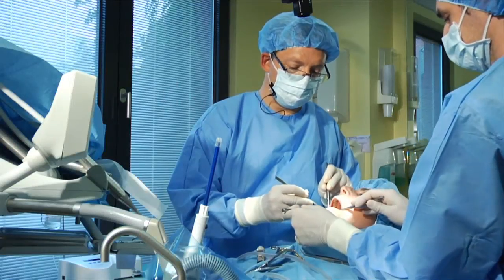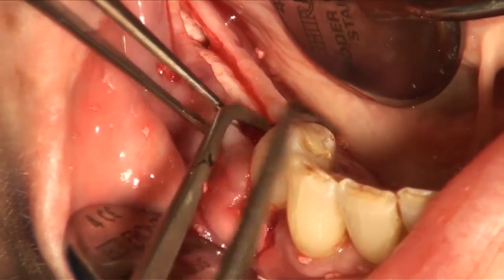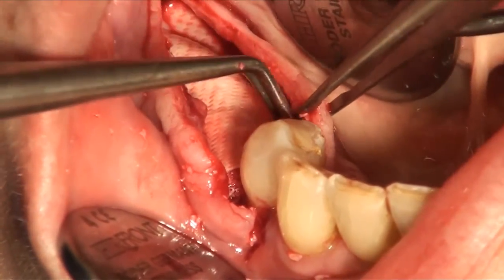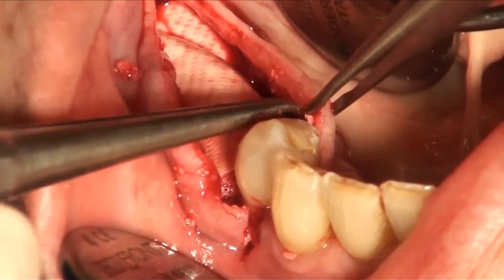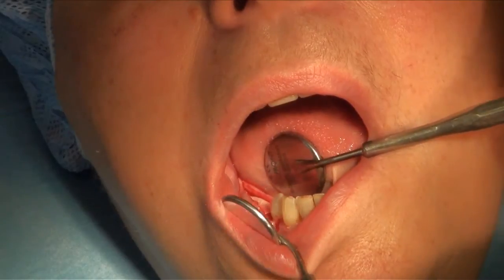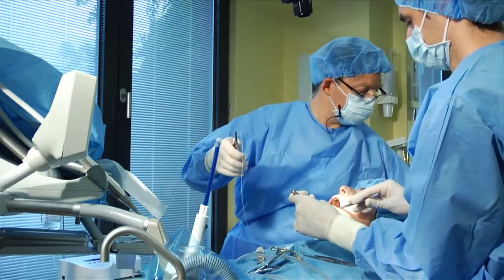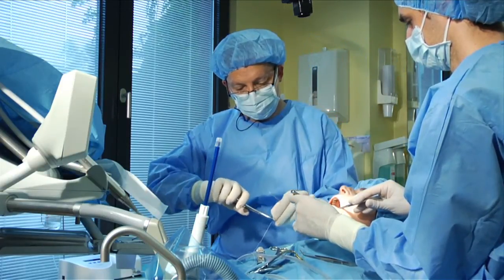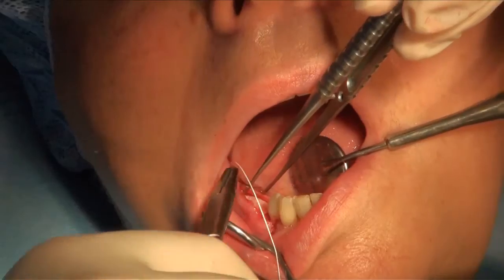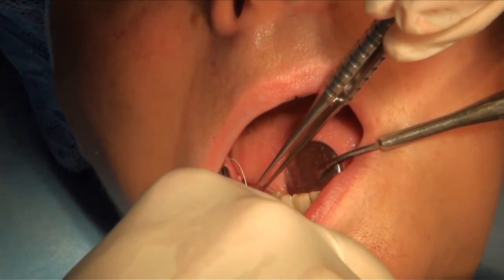So now we see soft tissue closure is completely achieved without any tension on the soft tissues. I have to take care of the membrane here. And we suture now, first of all, with Gore-Tex sutures as horizontal mattress suture, and then additionally combined with single stitches.